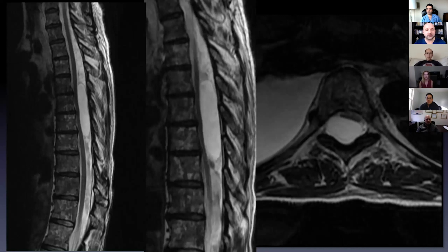A lot of times patients come in with an MRI of the lumbar spine, thinking that the problem is focal in the lower back. But a full and thorough neurological exam, testing the reflexes, testing for myelopathy, can lead you to potentially a different diagnosis. And a lot of times thoracic and cervical lesions are not picked up and are underdiagnosed because we're focusing on the image that the patient comes with. So I think this is a great case, but I'll see if John Shen or Coy want to jump in here.